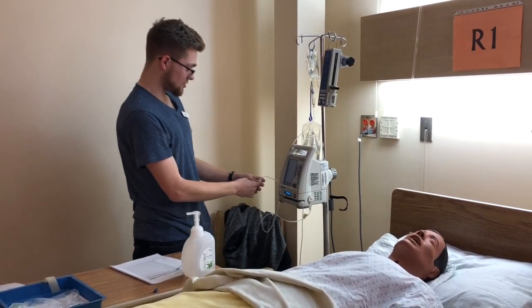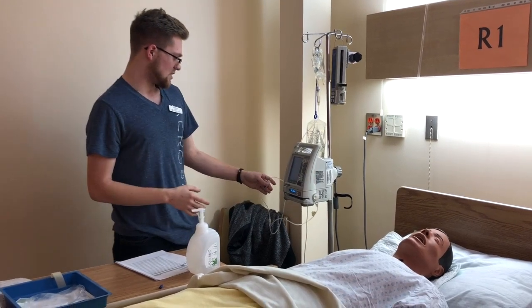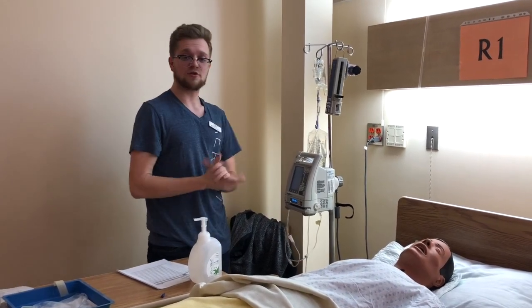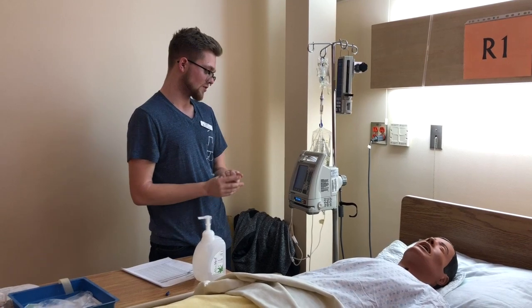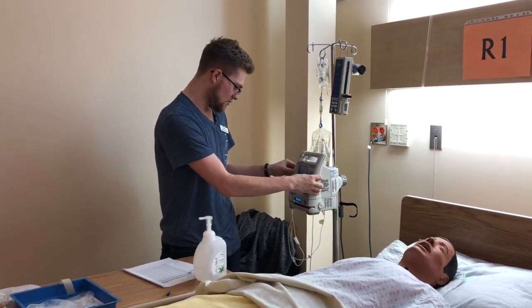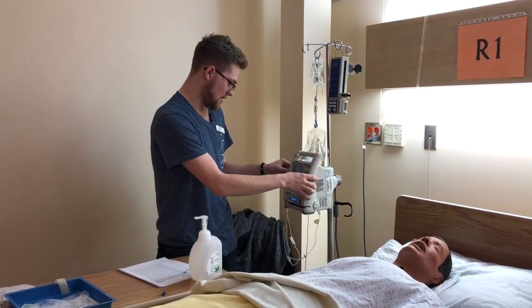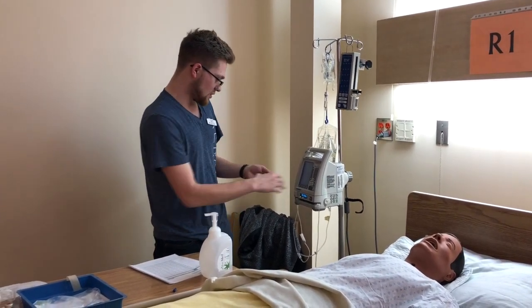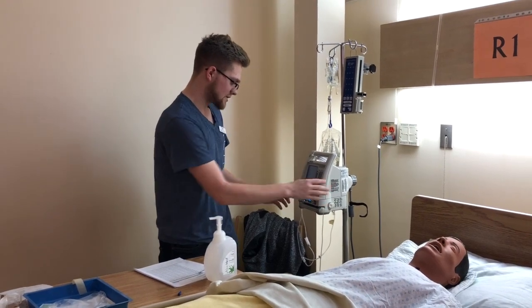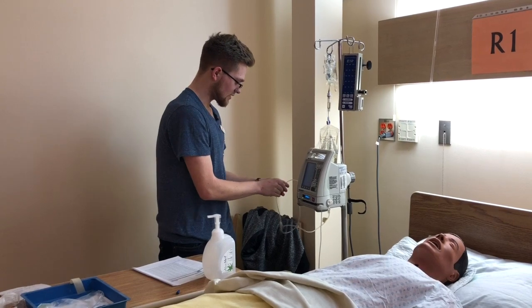So now we are going to set up the secondary infusion. So we're going to press secondary, and we need our volume and our rate. So we know that the rate is going to be 104 milliliters because we are infusing the 104 milliliters over an hour. So 104 an hour, and then we're going to say 104 mLs need to be infused as well. So you'll press confirm secondary, press start to begin secondary. So it's starting, and I'm going to unclamp this so that I can let it flow.